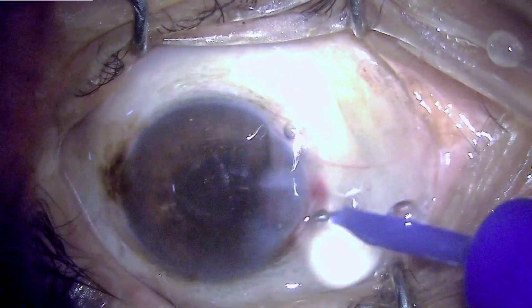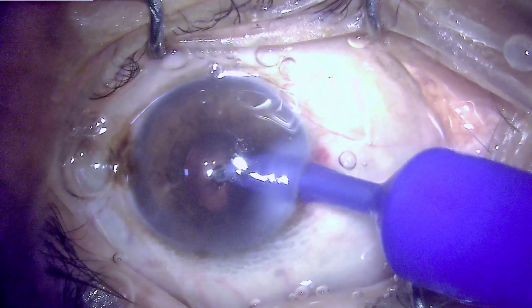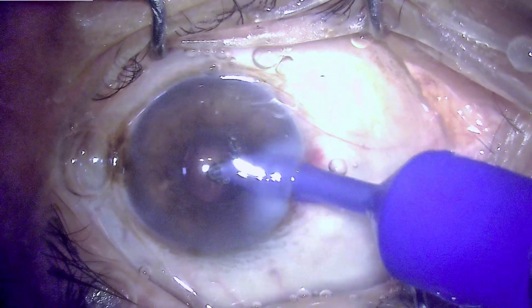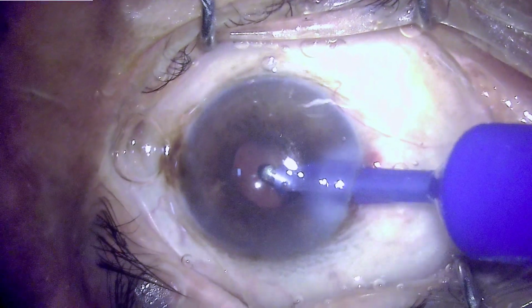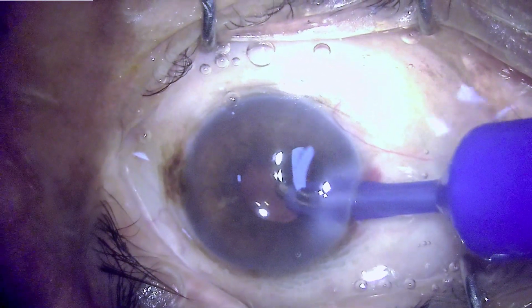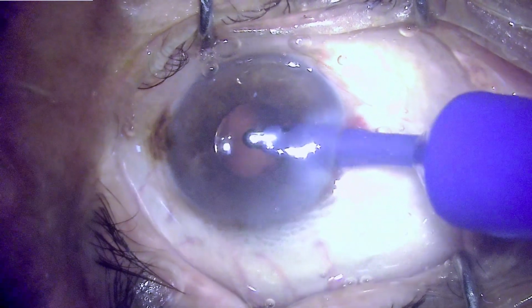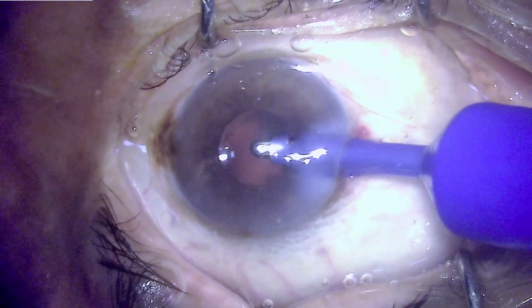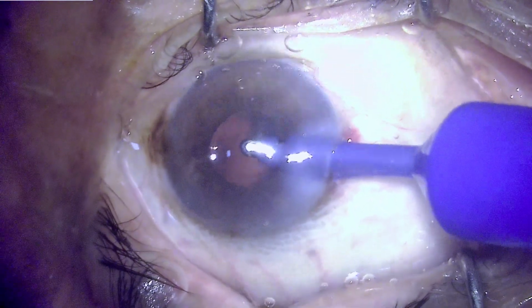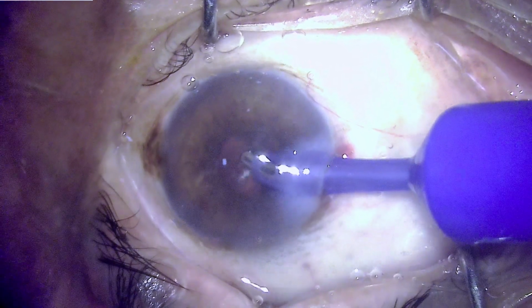The anterior chamber is having hypotony because of leakage of viscoelastic, and at the same time we have some amount of chemosis. But at this moment surgery has been nearly finished. The cornea is slightly hazy, but I think it is because of the waiting period exposure of the cornea after the topical anesthesia has been instilled, and this doesn't seem to be a pathological cornea to me, having any scar or any opacity.